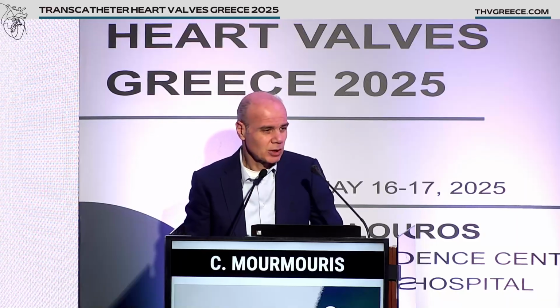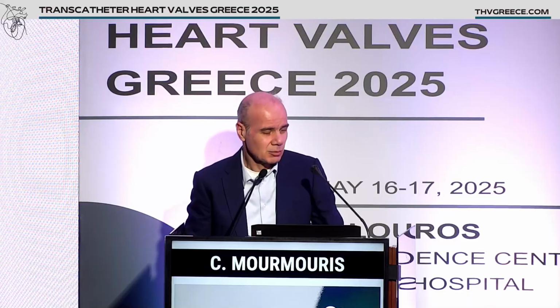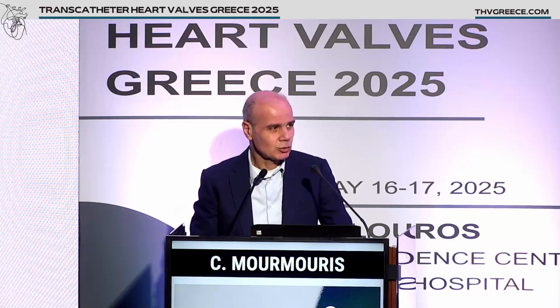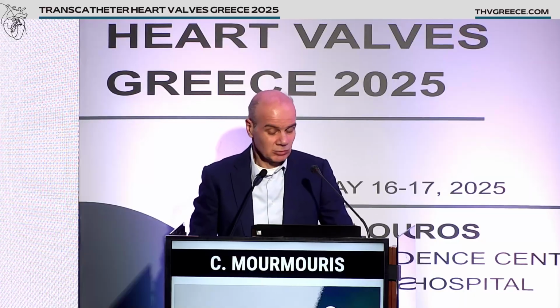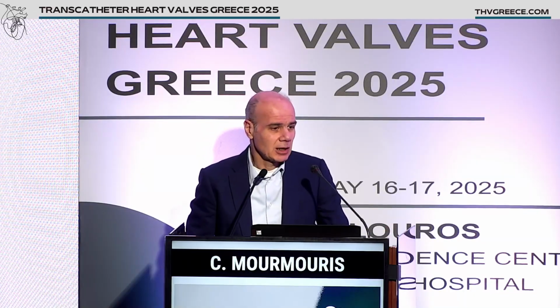I'm not sure about the temporal resolution, because nowadays it is about 65 to 74 milliseconds. I'm not sure that it's going to go lower using photon counting CT.